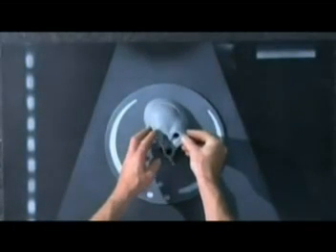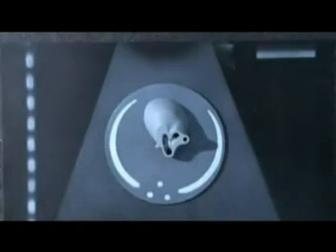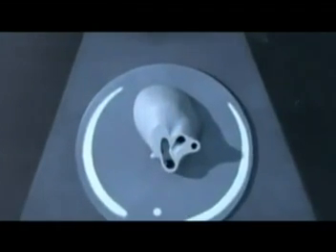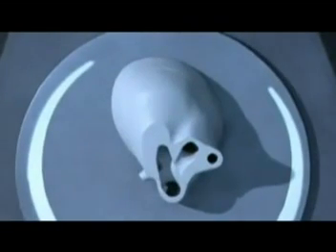Again, moving a fraction up towards the baby's head, you then start to see the aortic arch. In the previous section we saw the ductal arch run straight back into the descending aorta. Moving fractionally up, you still see the ductal arch, but as you come above the point where the right branch branches off, you then start to see the aortic arch come over the top of the right branch and head to exactly the same place that the ductal arch is. In other words, heading down into the descending aorta.